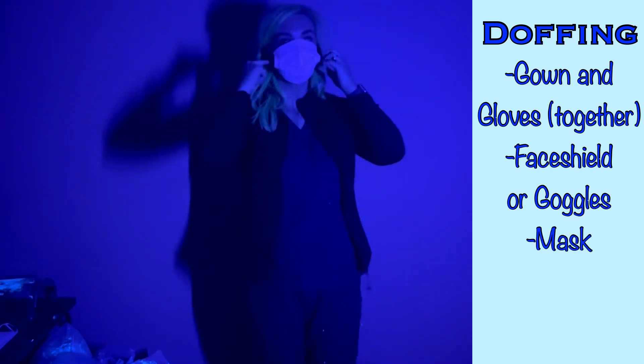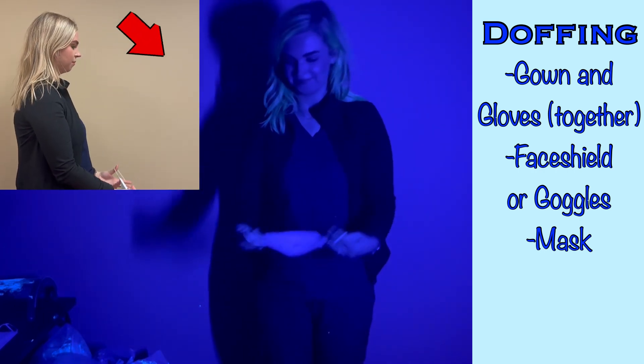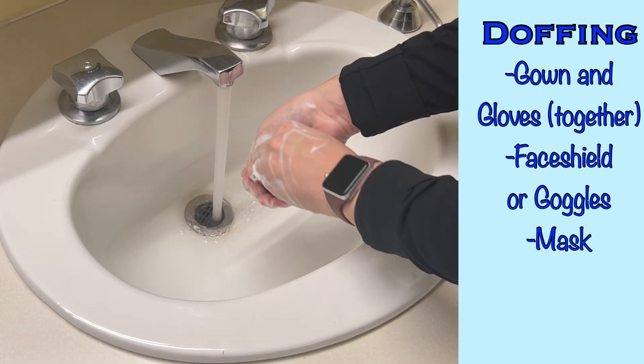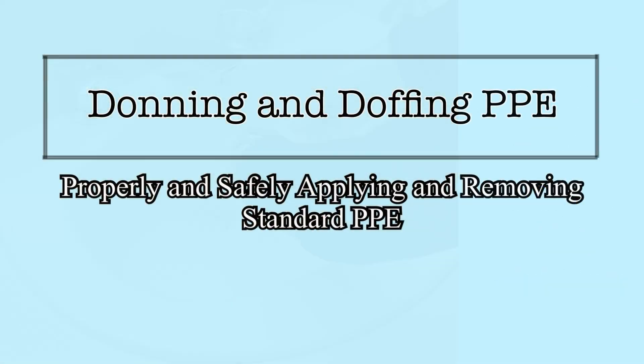Finally, remove the mask in much the same way. If your mask anchors behind the ears, grab from behind the ears and pull down and away from your face. If the mask ties in the back, release the ties and pull down and away from your face. Dispose of the PPE in the proper receptacle and then wash or disinfect your hands. PPE is worn to protect both the healthcare worker and the patient. It's important to not only wear the proper equipment to provide that protection, but also to know how to safely apply it and remove it to minimize any risk of spreading infectious agents. By following the steps demonstrated in this video, you will be able to keep both yourself and your patients safe from these risks.